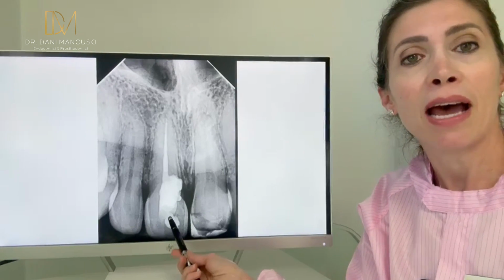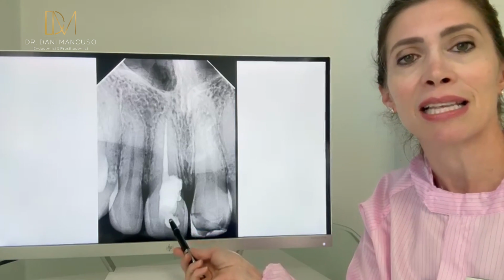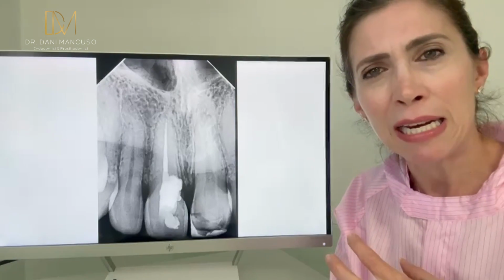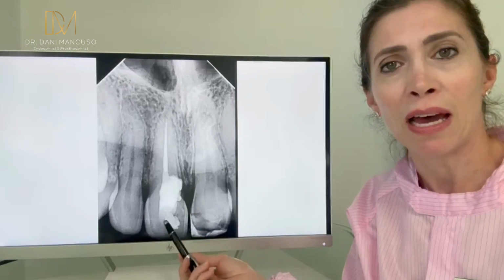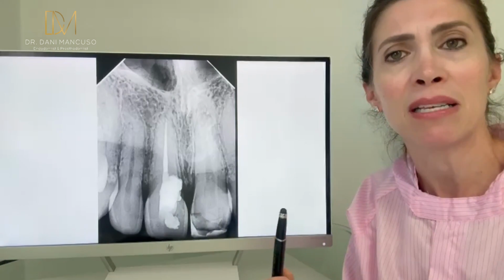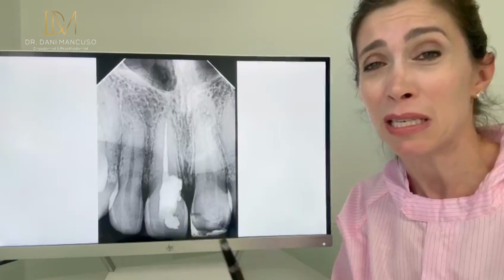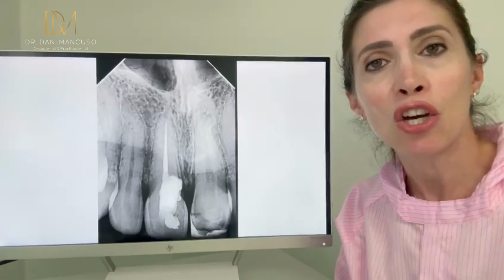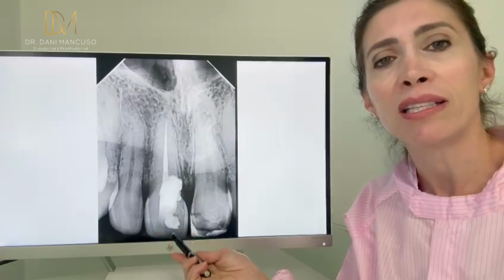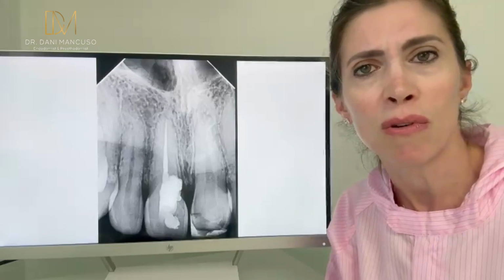So remember that you had a tiny resorption. The question was, I couldn't access that from the inside. I had to go on the outside. And the question was, do I need to really remove the enamel to do that, or do I leave that buried because I won't have any blood supply to feed that? That means that it will stay stable, won't grow. But what if it was bleeding so much that my concern was it could have a little bit of blood in it and that tooth will discolor? So I decided then to access and to do the composite on the palatal aspect of that tooth.